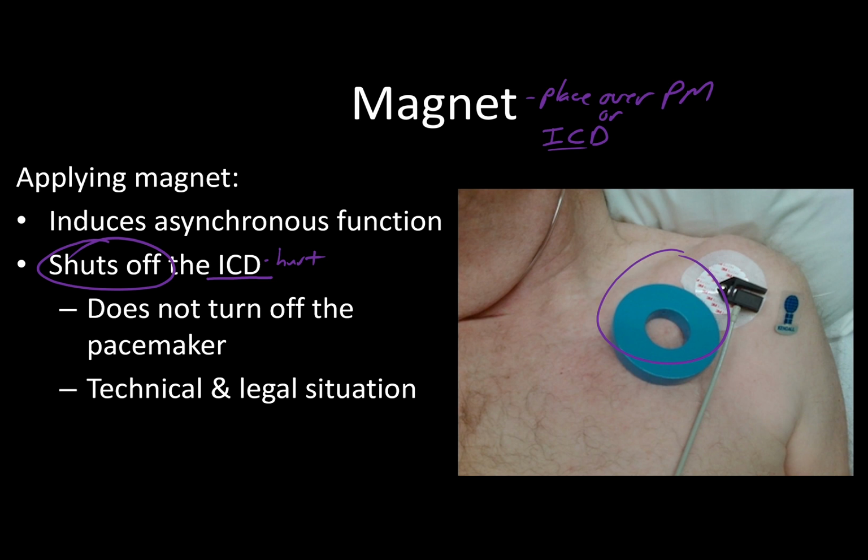The other thing it does for the pacemaker is it induces asynchronous function. What does asynchronous function mean? Well, I'm going to write that out real quick in green. Asynchronous function is where the sensing is turned off, and it paces continuously no matter what.